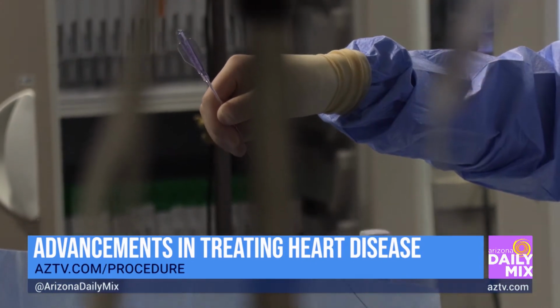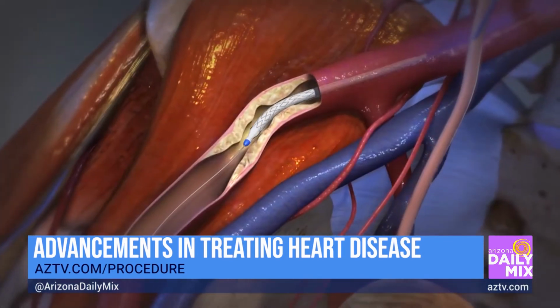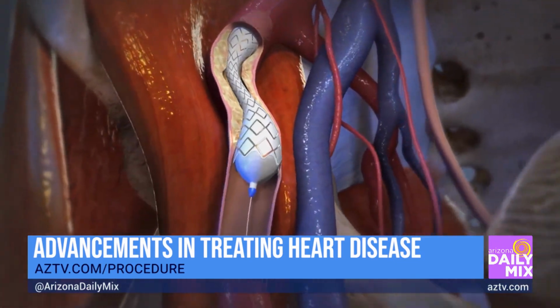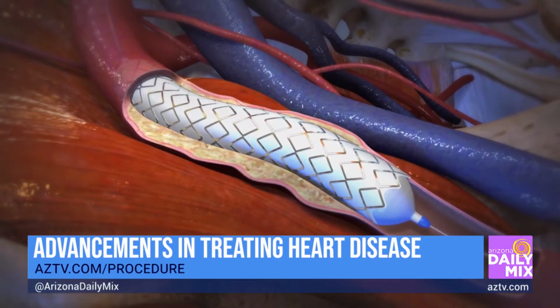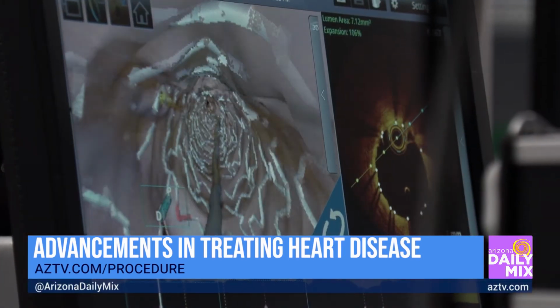If you look back 20 years, almost invariably it was done through the groin, by going in what we call the femoral artery in the groin. But technology has changed. Things have been miniaturized. And so now 90% of everything we do in terms of stenting procedures, we go in through an artery in the wrist, we pass a long tube up to the heart, and by going through the wrist, about half the time these patients can go home the same day. Now think about the evolution. When we first started implanting stents in 1994, these patients would stay at the hospital for 3 or 4 days. Now they stay for about 3 or 4 hours before you send them home.